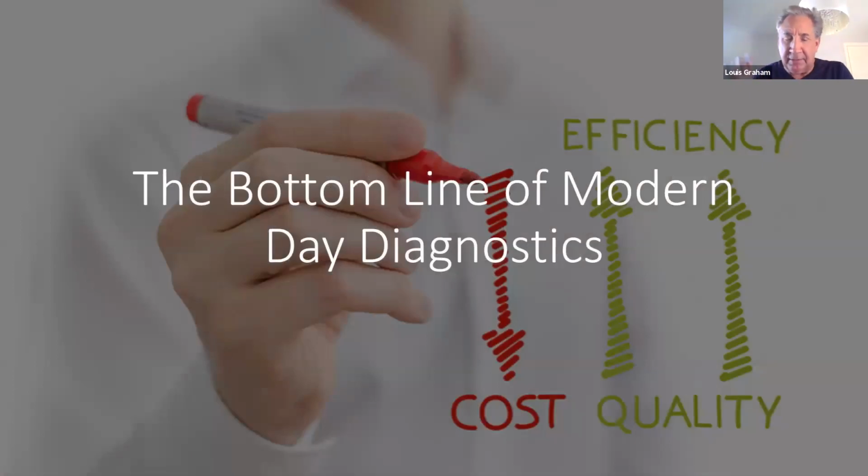Because the bottom line of modern diagnostics is I want to lower the cost. How's that done? I want to lower the failure rate. Imagine if you did a crown on a tooth and it had a periapical lesion, but you couldn't see it in 2D, but you could see it in 3D. And yet you did the crown, you couldn't see anything in 2D, but a year later, they come in and they're swollen, and now you have an abscess. What if you could have seen that before doing the crown? That's a cost failure to the patient.